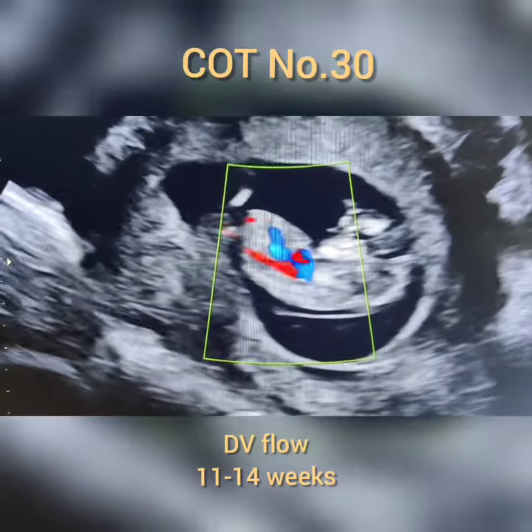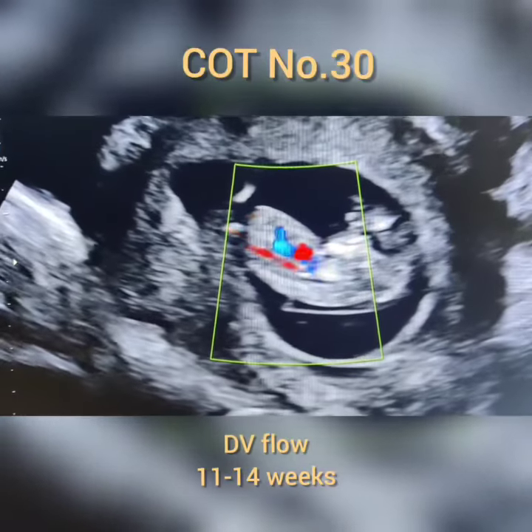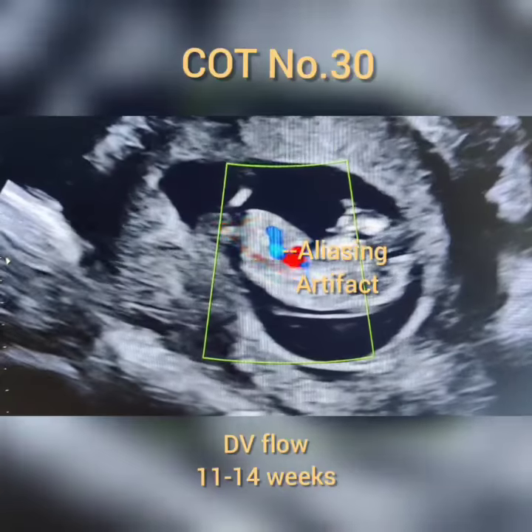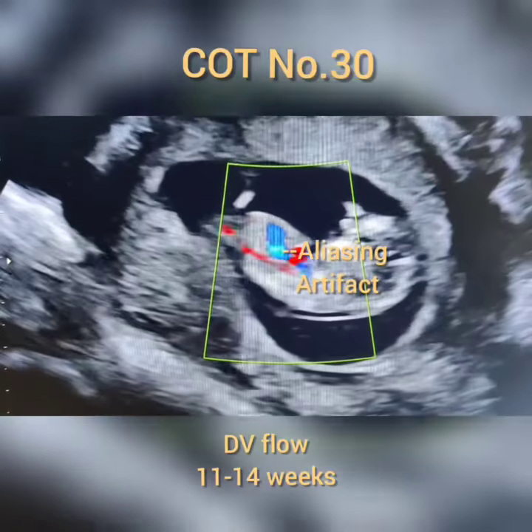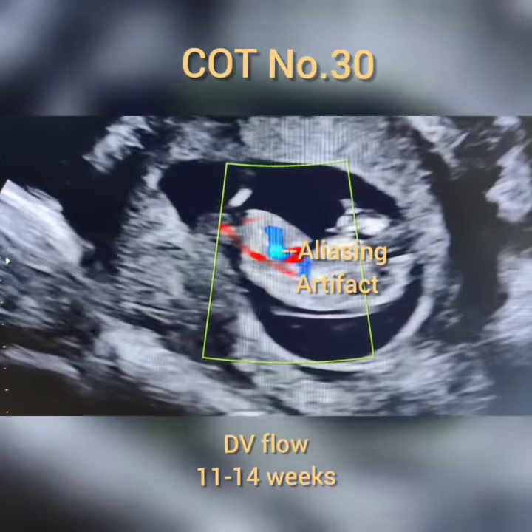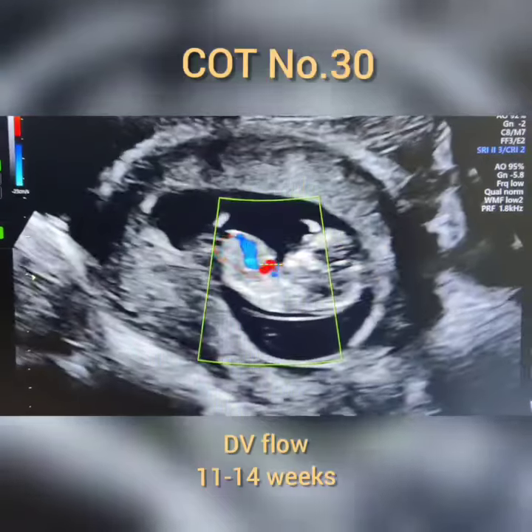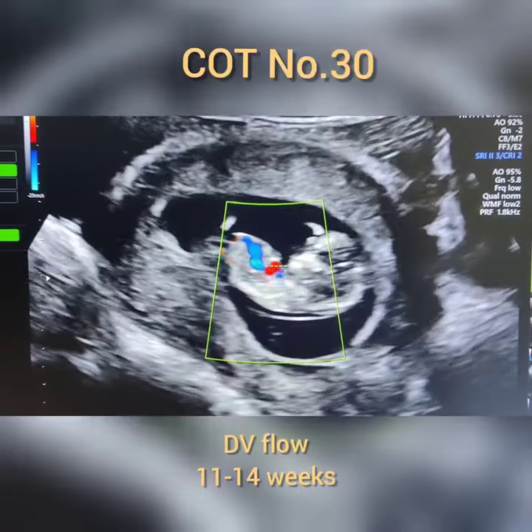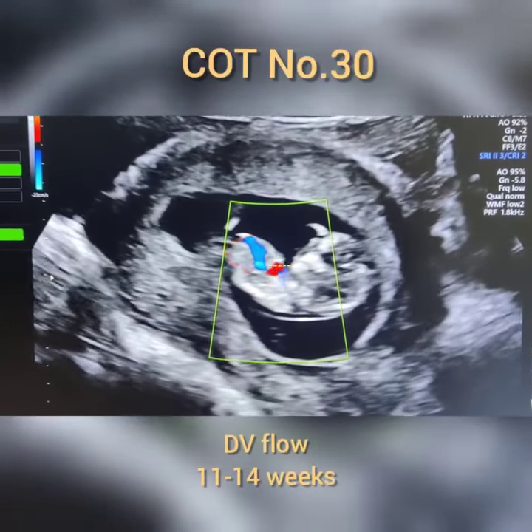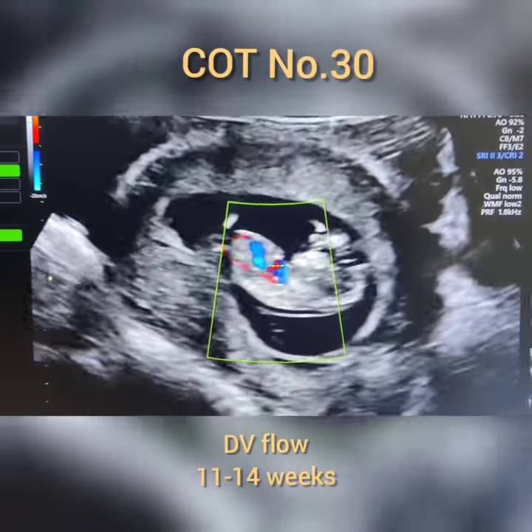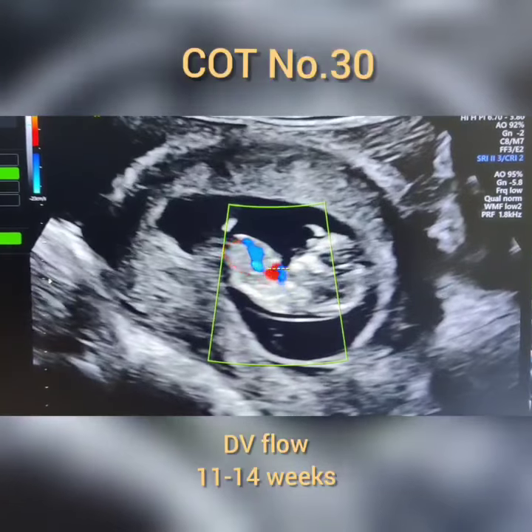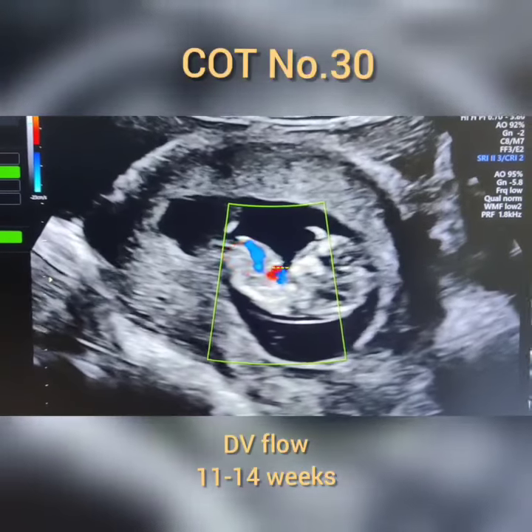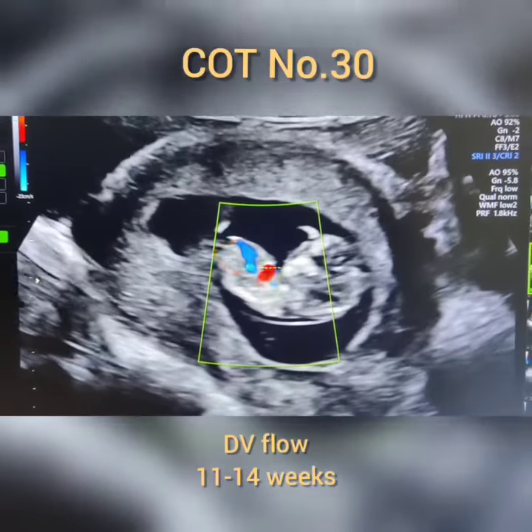This is an 11 to 14 week fetal ultrasound — what you're seeing is the sagittal section of the fetus. That white color thing is the aliasing artifact, which indicates where the ductus venosus (DV) is going to arise. So it's an artifact from which we know where the DV is going to come from — that's why it's called the aliasing artifact.